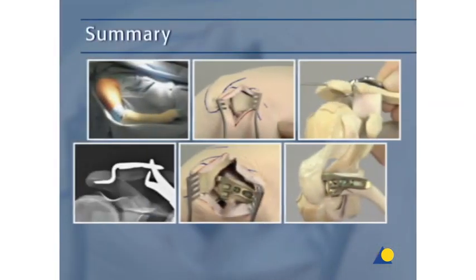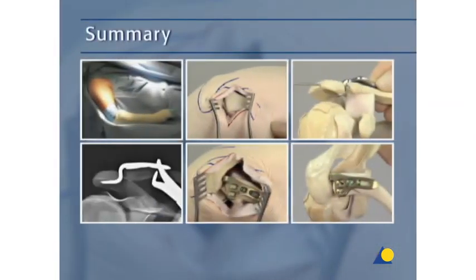This presentation has demonstrated the application of the four-hole LCP clavicle hook plate for both an AC joint dislocation and a lateral clavicle fracture. In general, two bicortical screws in the medial part of the plate are sufficient. In both cases, it's essential that the correct position of the plate and the clavicle are maintained.